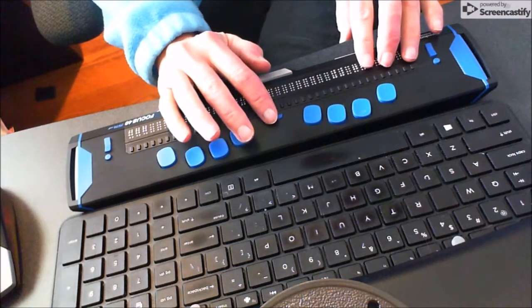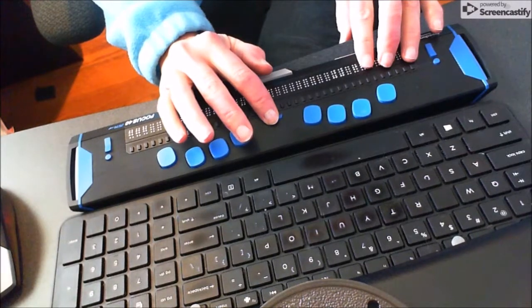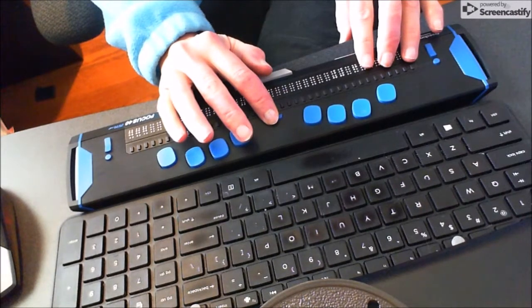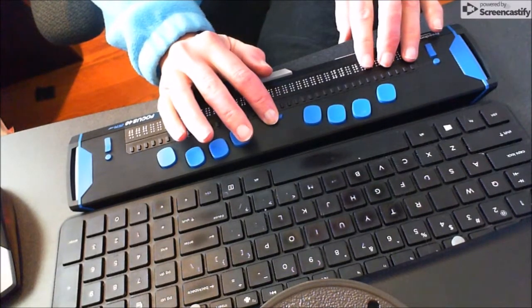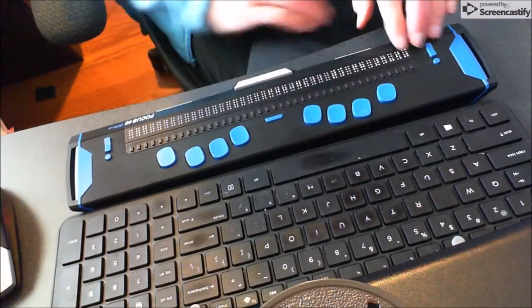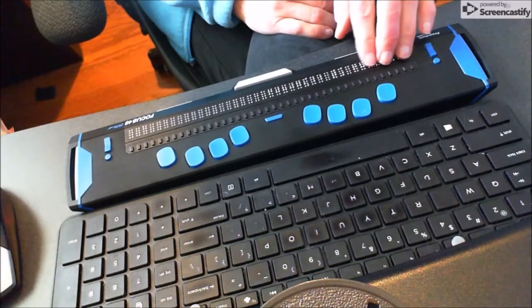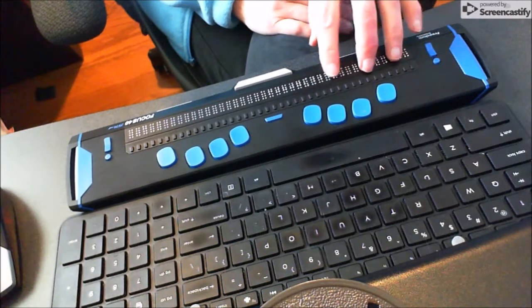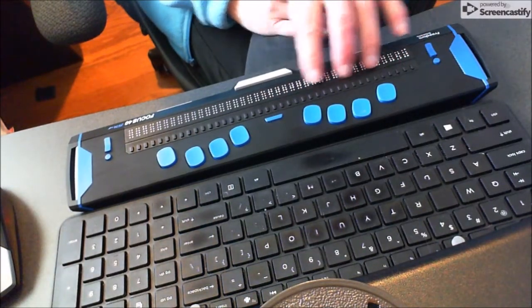So I'm going to press the menu button and it's going to go into the menu options. Here I am, it says Focus 40 and gives me the serial number and everything.